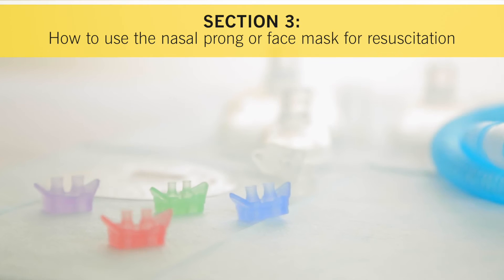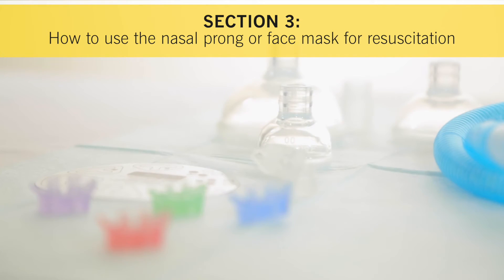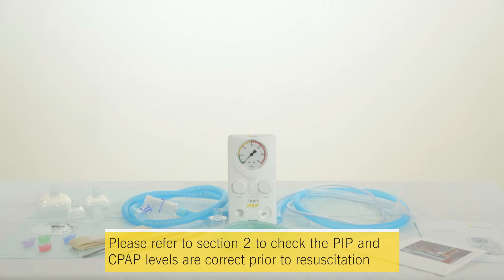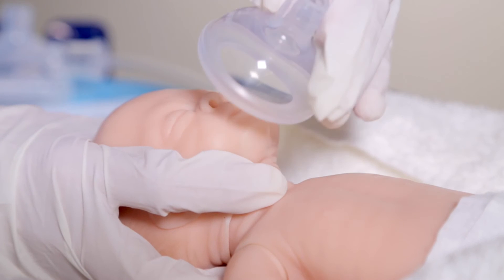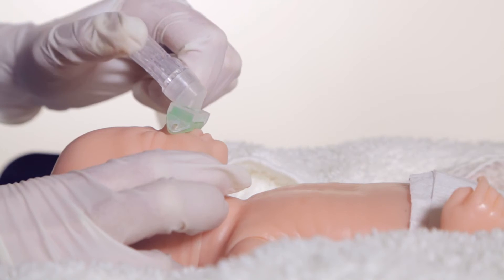Section 3: How to use the nasal prong or face mask for resuscitation. Please refer to Section 2 to check the PIP and CPAP levels are correct prior to resuscitation. Resuscitation can either be performed using a standard face mask or a nasal prong.